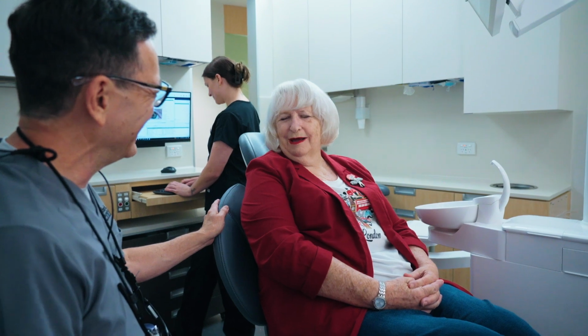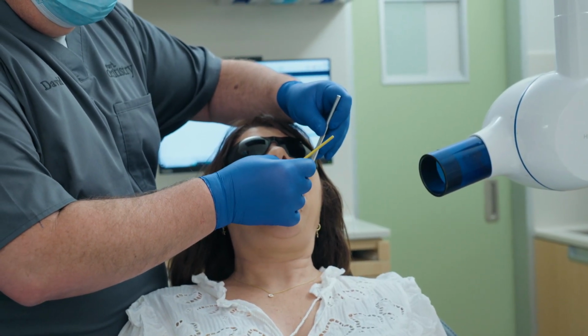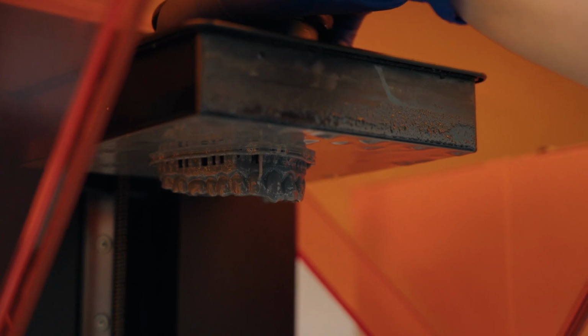In the smile design space, we also use this technology to redesign people's smiles that are facially generated. It allows us to do a smile test drive where we can use our 3D printers to produce our diagnostic models that we can actually try in, as a proposal, before we even do it, and it really gives people a preview as to where the case is headed to make sure that we're all happy before anything gets done.